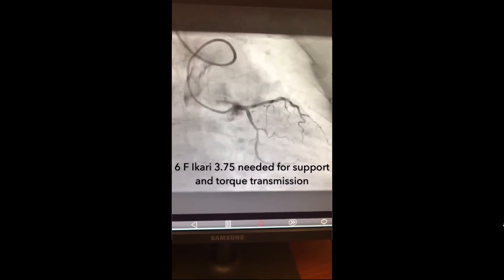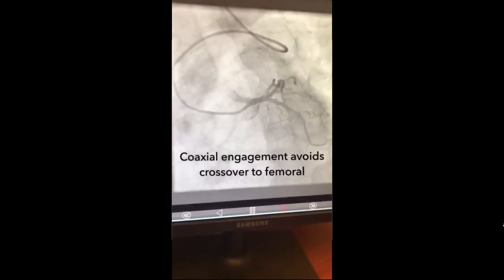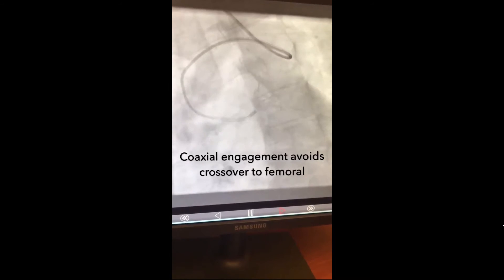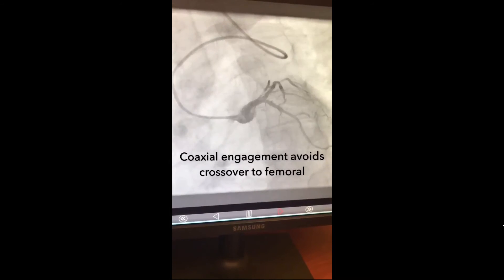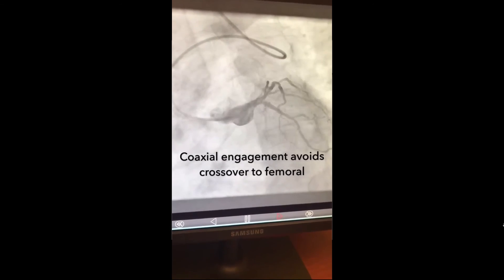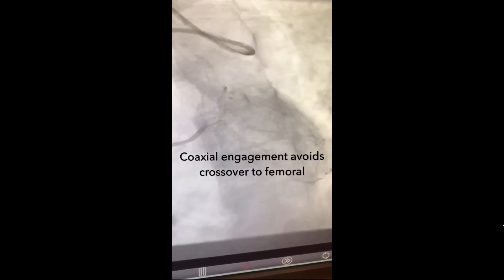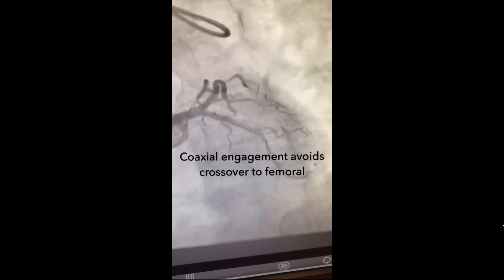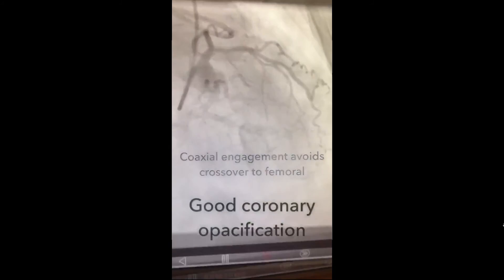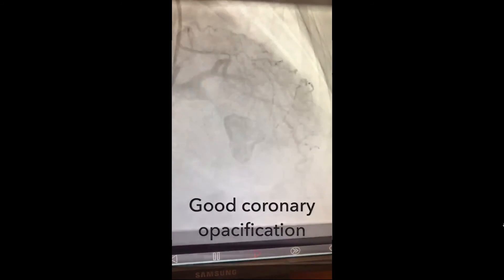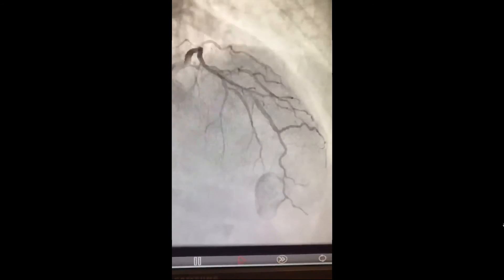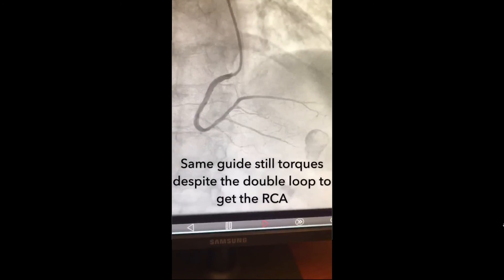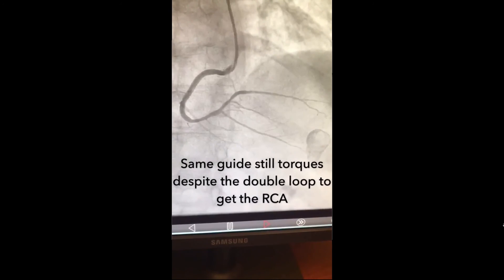Going straight to a guide catheter would be preferable, since once it's seated, you can proceed with your physiological assessment or percutaneous coronary intervention. In this case, the same Ikari guide was used and rotated over a stiff angled glide wire to the right sinus of Valsalva to engage the right coronary artery.